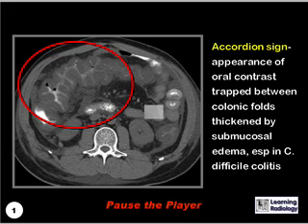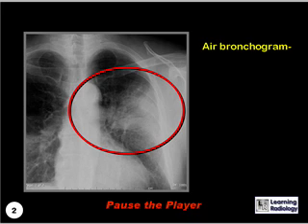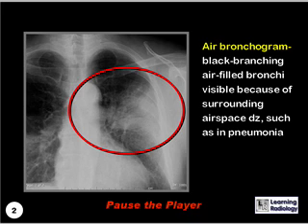What sign is being demonstrated by the infiltrate inside of this red circle? This is an air bronchogram, which are the black branching structures representing air-filled bronchi, which are visible because there is something other than air surrounding them in the air spaces, such as in this case, inflammatory exudate in pneumonia.